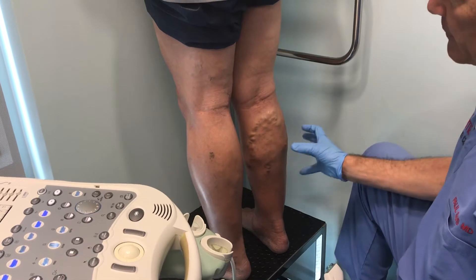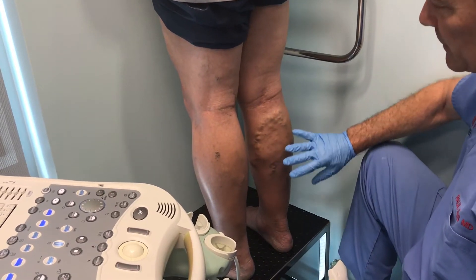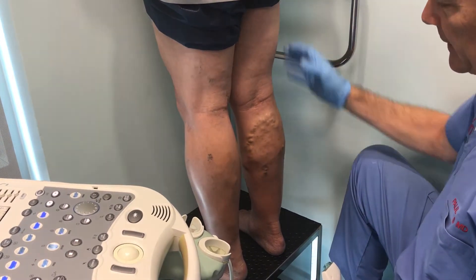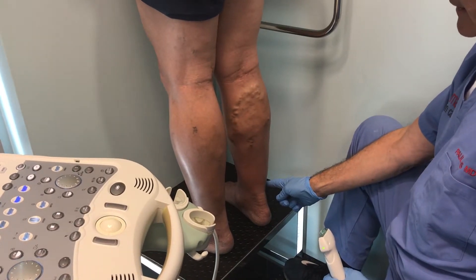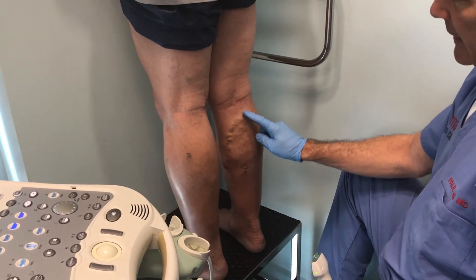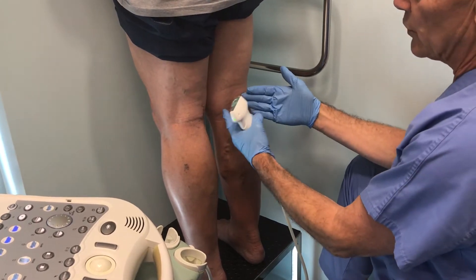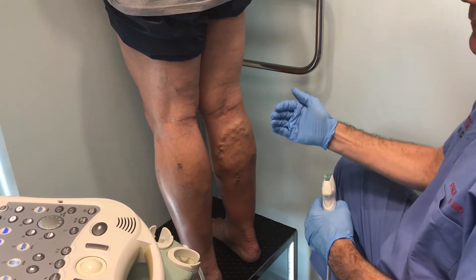Normally all the blood that's circulating on the surface of the leg should be gently going off to a vein and then turning into the deep vein at some point of the leg. There is a superficial vein that starts on the side of the ankle — it's called the short saphenous. This vein, if I were to pull the skin away, you'd see it go up the leg and turn in and go into the deep vein here. There's a little one-way door supposed to let the blood go in, continue through the deep vein, and keep it from coming backwards.